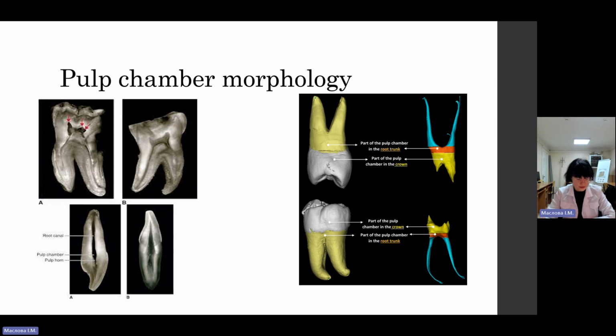Planes of curvature. Radiographs from a labial or buccal projection show only two planes of curvature. Many curvatures are towards or away from the viewer. For this purpose, there exists another method of investigation, 3D modeling. You can see the results which the dentist can obtain after computer 3D modeling on your screen on the slide. Please put your attention on this.